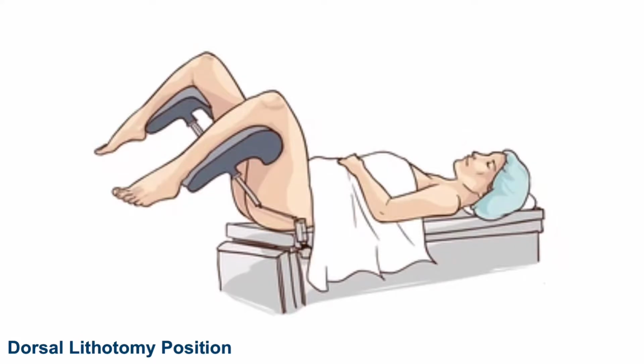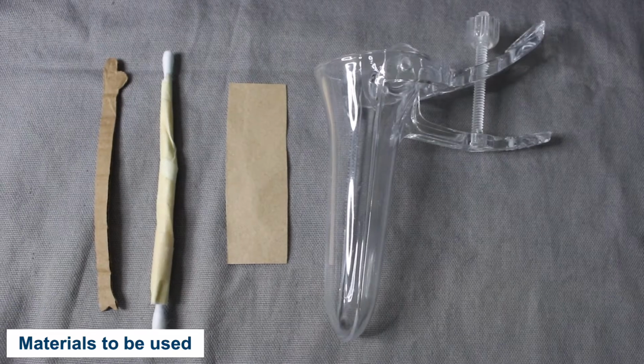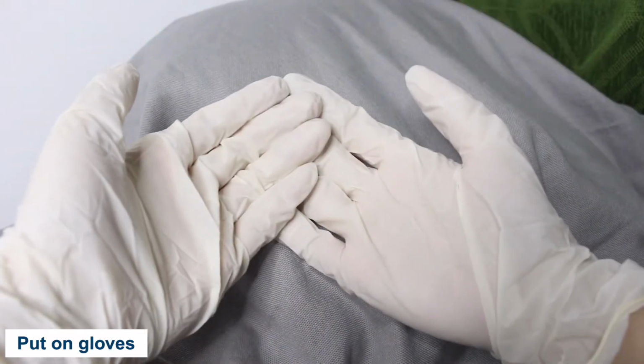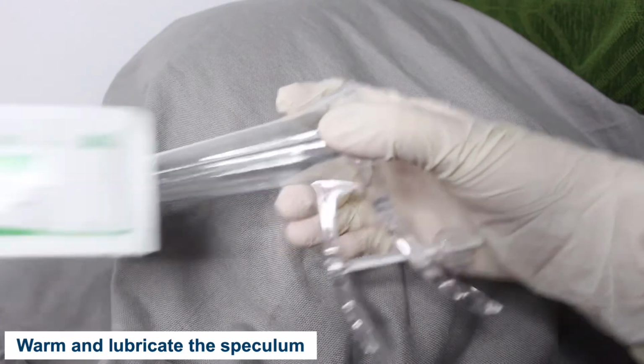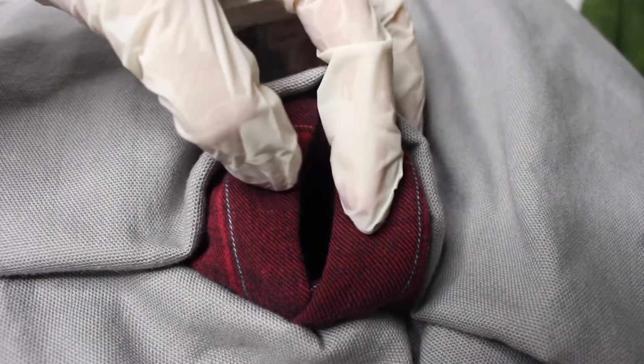Place the patient in a dorsal lithotomy position. Choose the appropriate speculum size for the patient. Put on gloves and observe aseptic technique throughout the procedure. Warm and lubricate the speculum. Part the labia using the non-dominant hand.